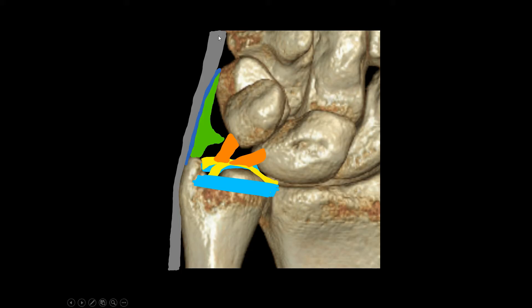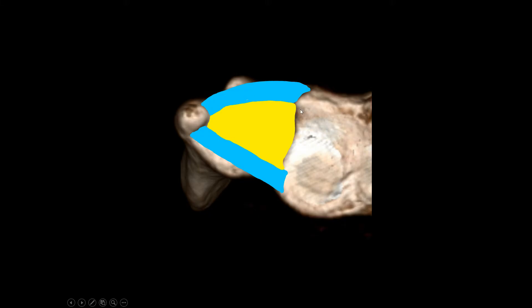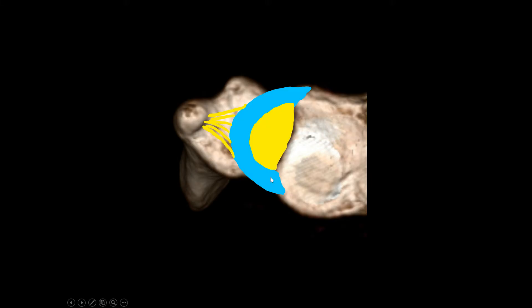The extensor carpi ulnaris tendon itself does not belong to the TFCC. Typically people think of the TFCC as a triangular structure with dorsal and volar radio-ulnar ligaments, but if you look closely on MR images, it looks more like a round structure with a central portion. From this round structure you have the lamina inserted into the fovea and the ulnar styloid, and the dorsal and volar radio-ulnar ligaments are shown in blue.